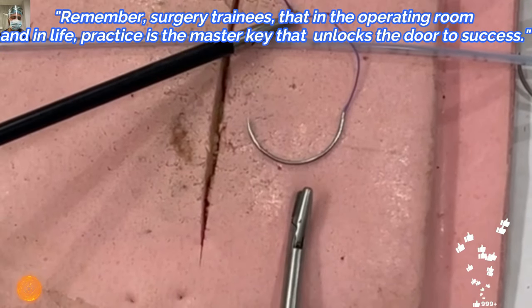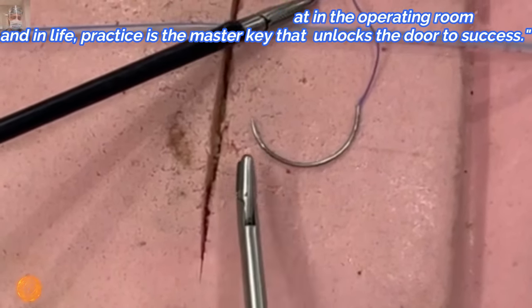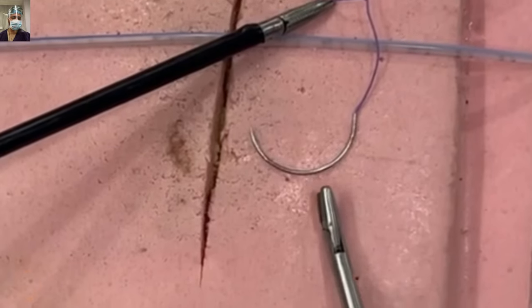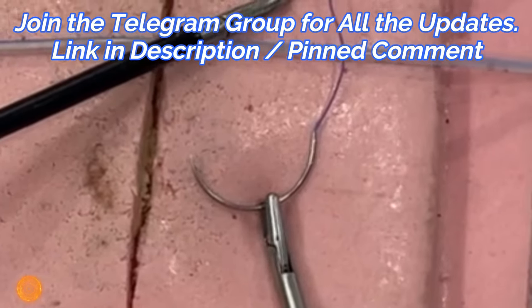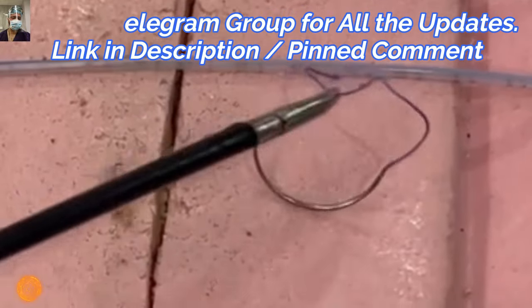See again — you approach at 90 degrees and it will automatically auto-correct and get into the right angle. This is a very good technique you have to master and have in your armamentarium. Here again in a close-up view: as you press, it will automatically get to the right angle.